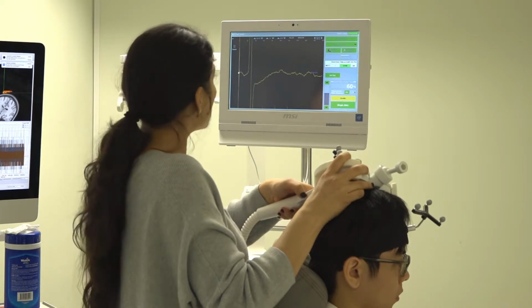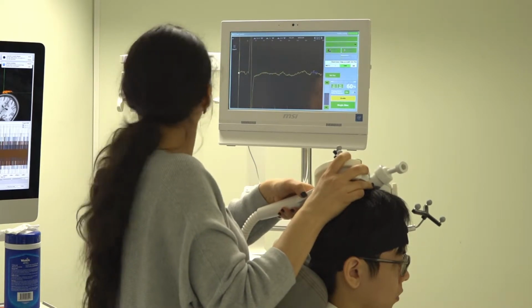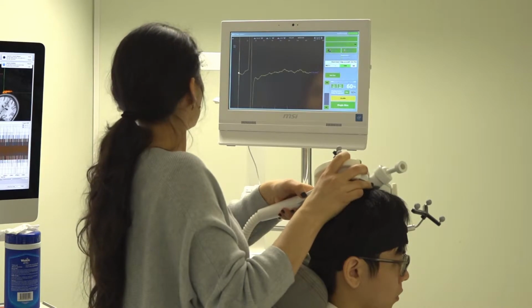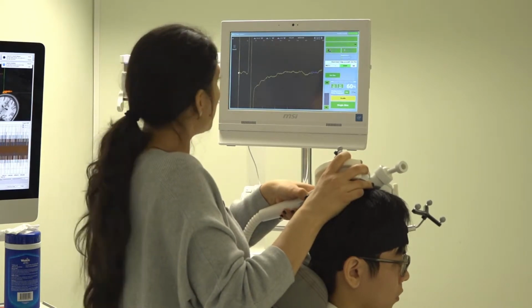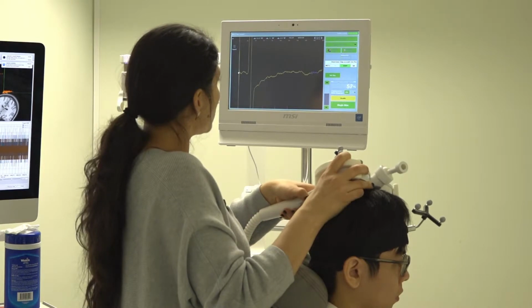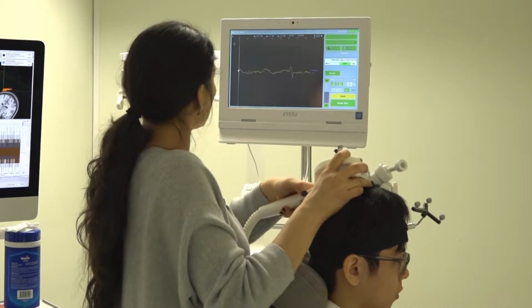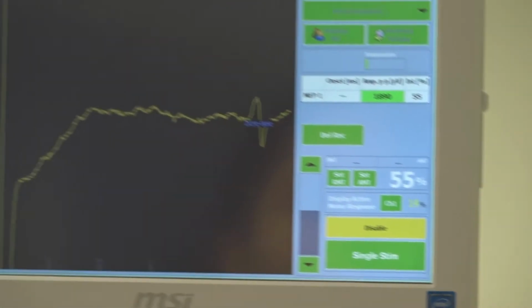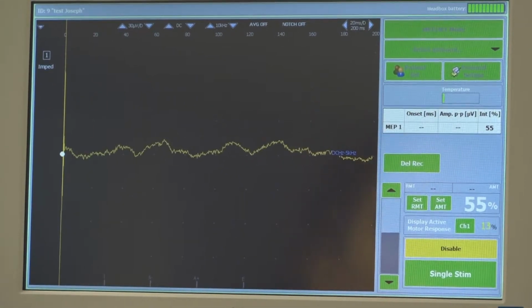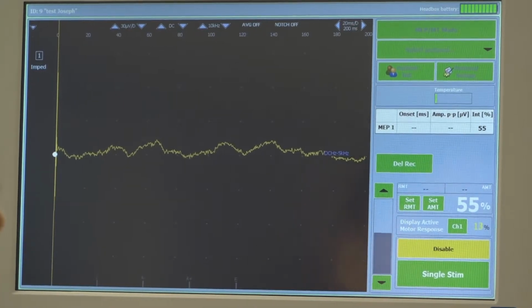So I go down to 60. 2, 3, super high. I need to go low. Relax. That's easy, relax, really relaxed.